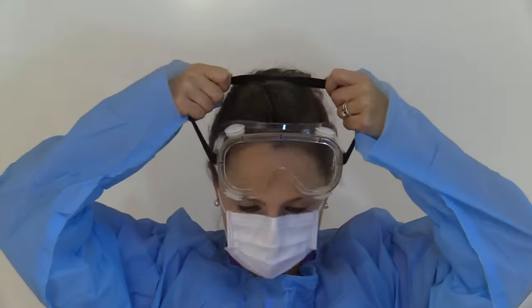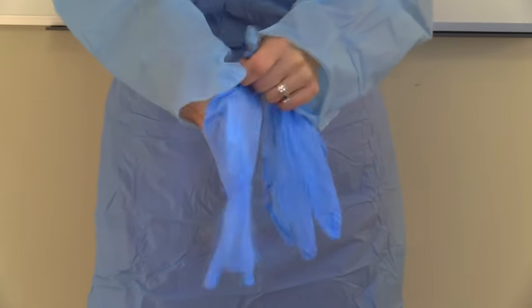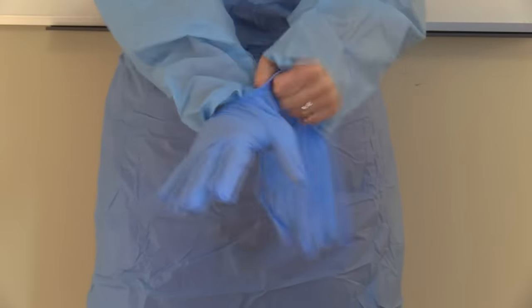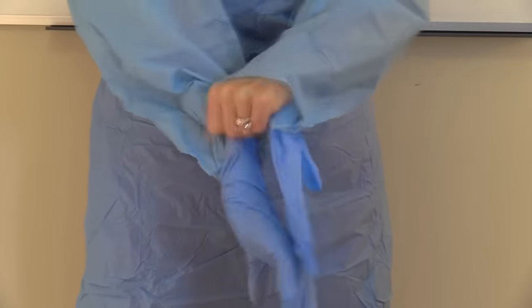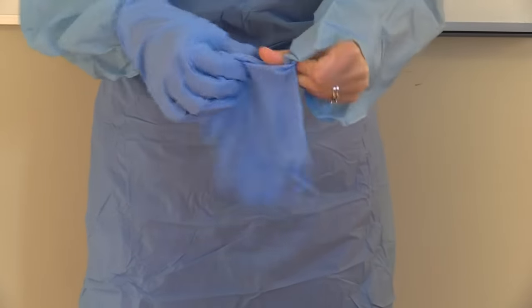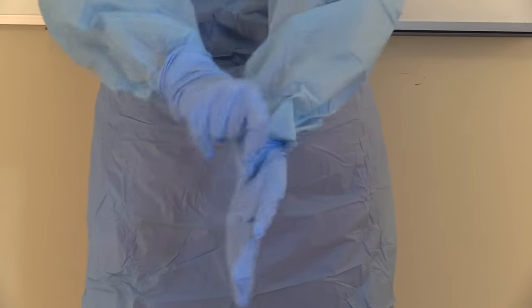Next, you will place the goggles or face shield onto your eyes, making sure they fit snugly but not too tight. And finally, don your gloves, making sure that you pull the cuff of the glove up over your gown for extra protection. And this is how everything will look.